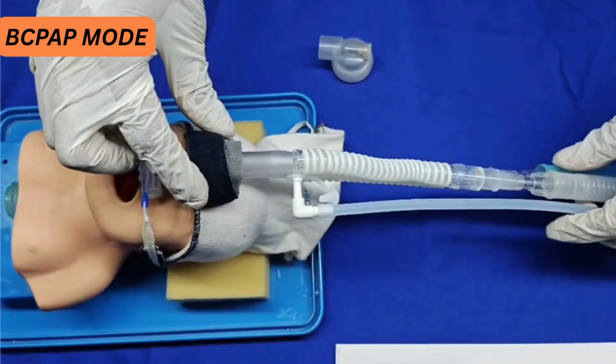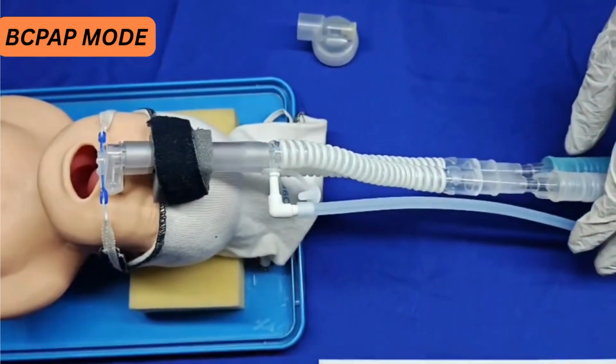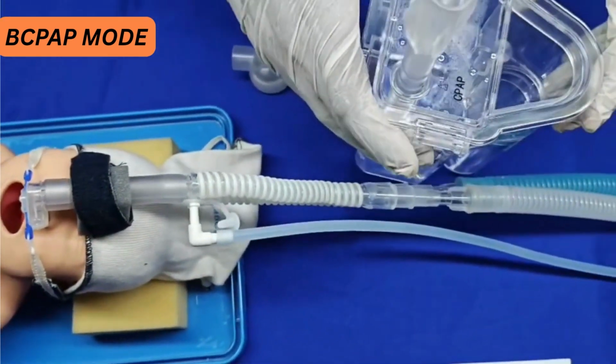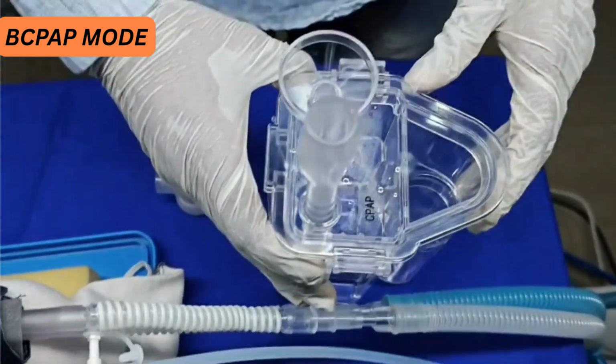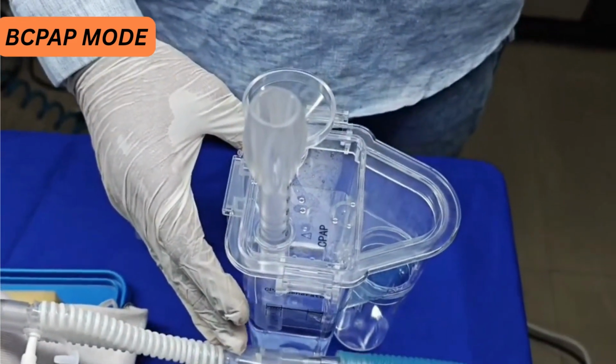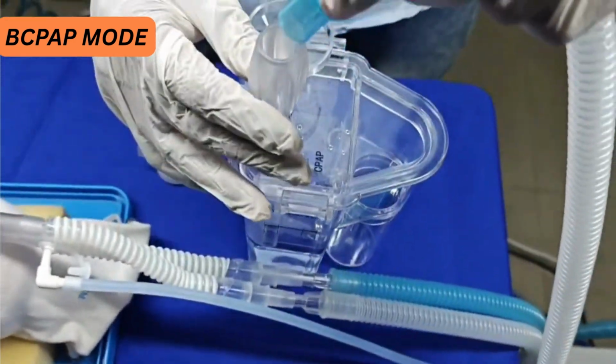After attaching the ventilator circuit and proximal line like this into the baby, one more thing we need to confirm, that we require a bubble CPAP jar, as you can see here. Now we need to connect the expiratory limb of the ventilator circuit, this is the expiratory limb, into this bubble CPAP stick.